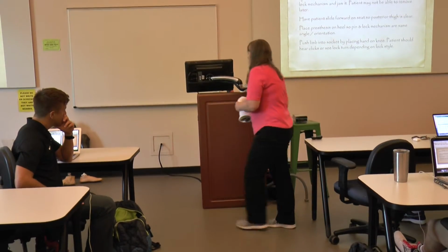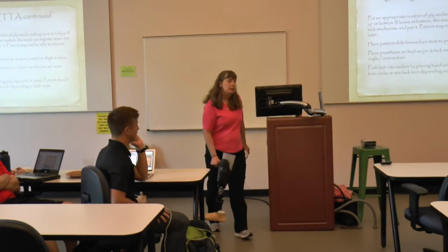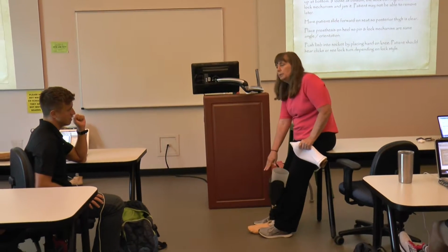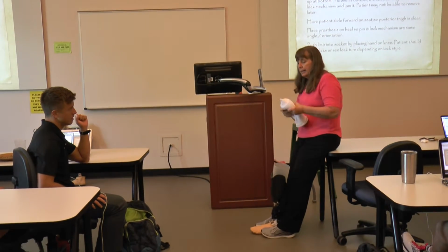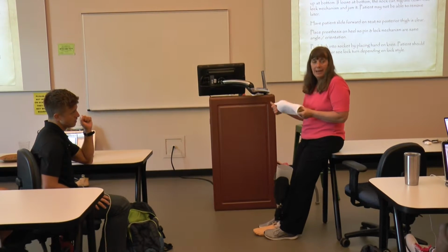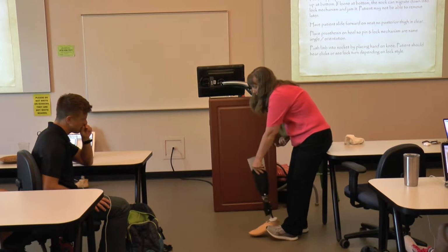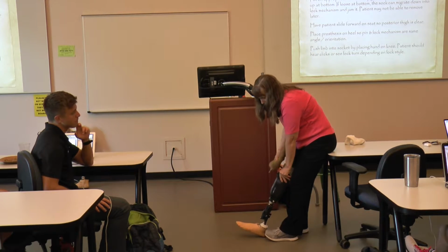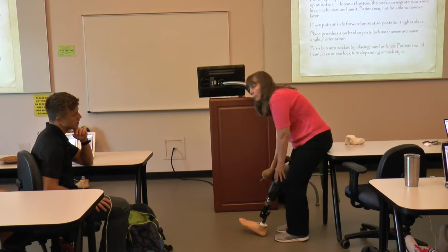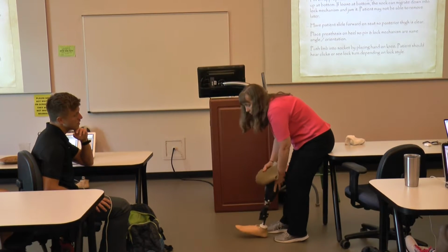Then you want to take the prosthesis, and you're trying to think of the lock system as a tube, not as a hole in the bottom. I need this pin and that tube at the same angle to slide together. So you actually put the foot back on the heel and then push your knee down into it. Don't pull the prosthesis on. You literally sit the heel on the ground.